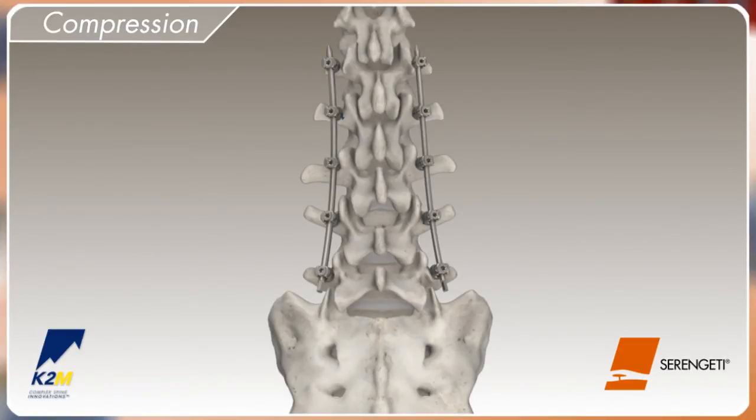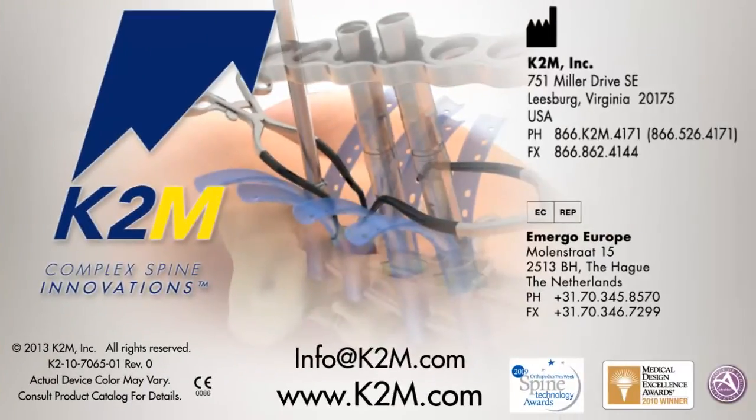The Serengeti Minimally Invasive Retractor System from K2M, Complex Spine Innovations.